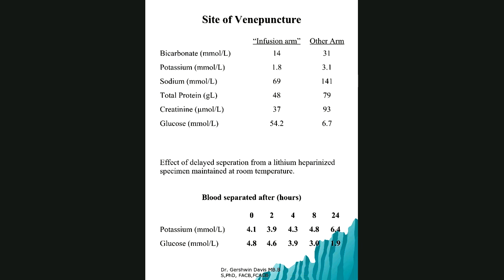Right. So here, take a minute to look at these. Examples of pre-analytical error, that's a big topic here, right? I didn't go through this in detail in your presentation, so now's the time. Look, this is pre-analytical error due to site of venipuncture. Pre-analytical error due to delayed separation. So take a minute and look at both the top one and then below, and then we talk about it. See if you can figure out what is happening with the site of venipuncture. Look at the infusion arm and the other arm, and then make some comments. So I'll keep quiet for about half a minute so you can think about it, and then we talk about it.